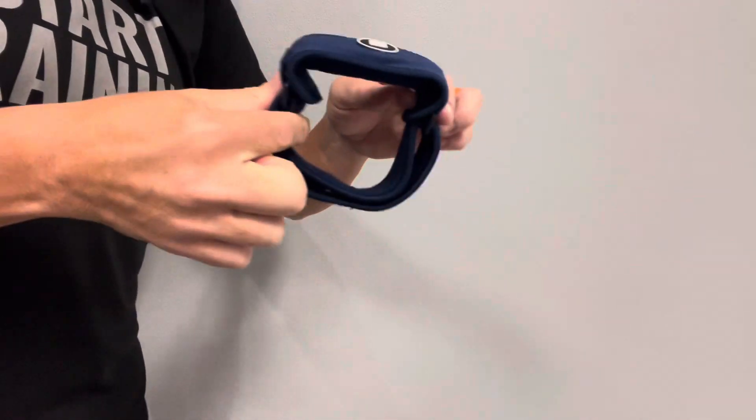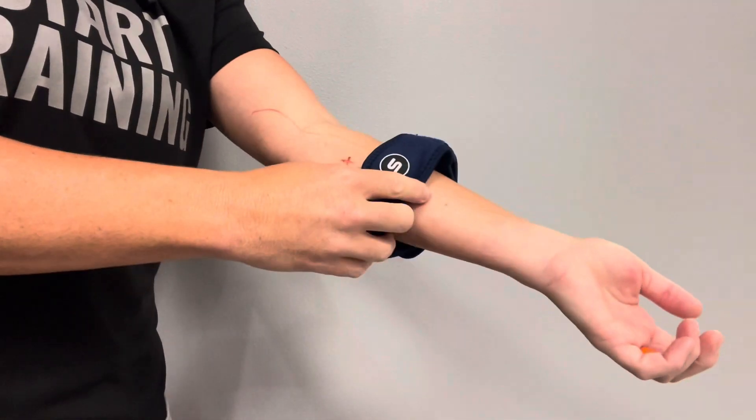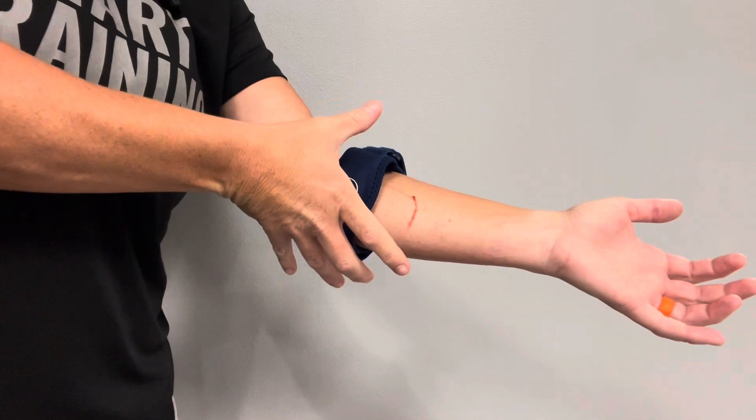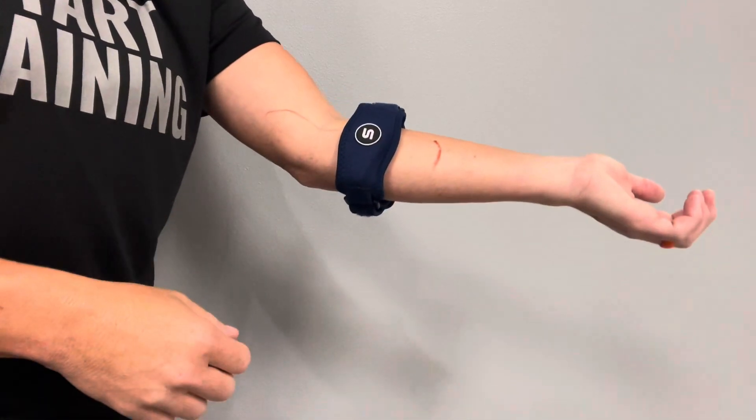I'm going to take the brace that I've already hitched together and slide it right on. This brace is nice because it comes with three adjustable size straps, so whether you have a bigger or smaller forearm you'll be able to adjust it to fit correctly.